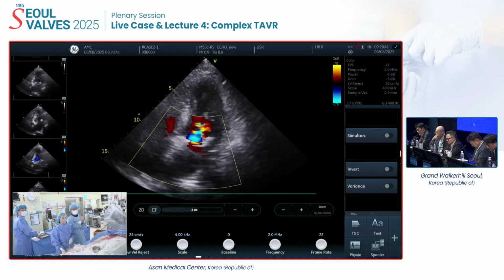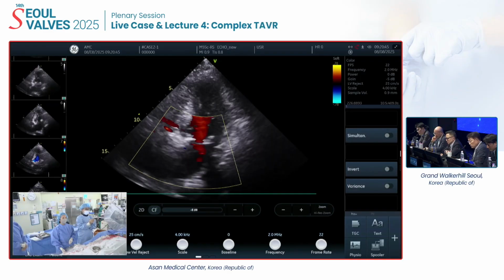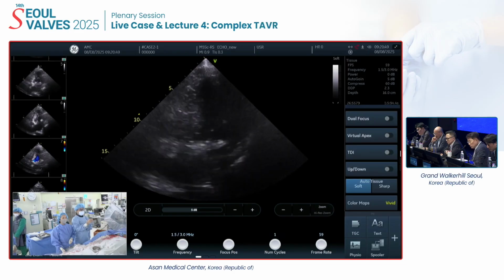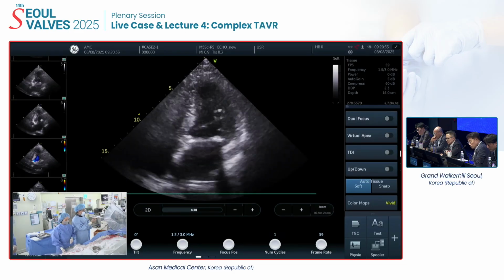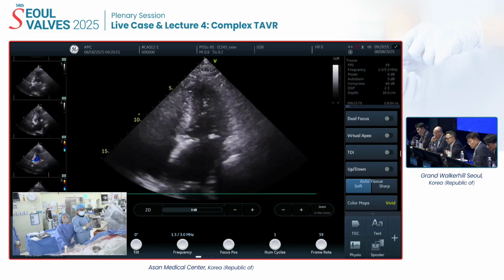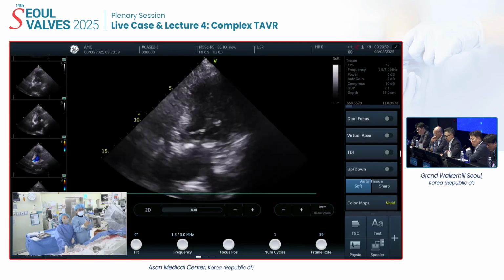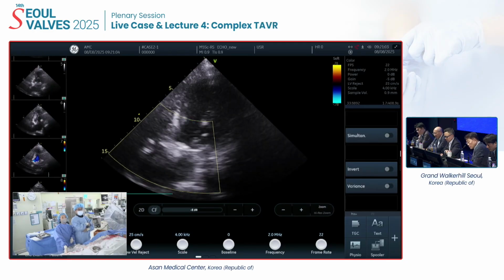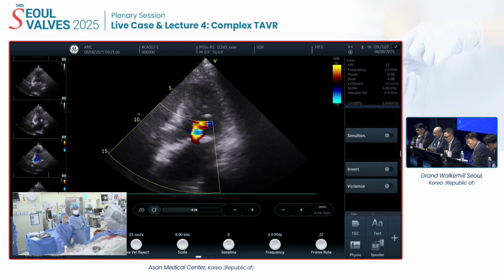At the time we don't know what is dropping the blood pressure, and we try to increase norepinephrine and everything, but this does not resolve. Then we give full hydration, stop the norepinephrine and wait, and the vital signs stabilized. There was a typical suicide LV.